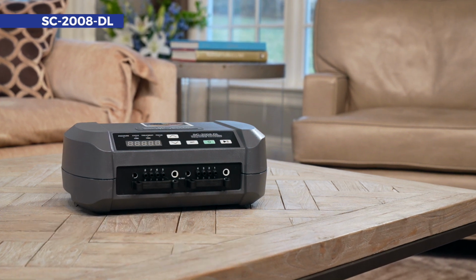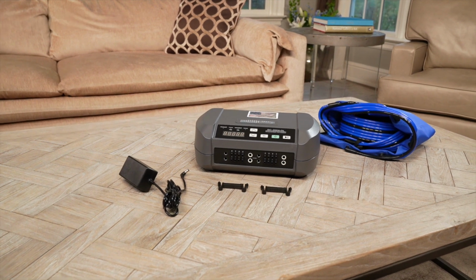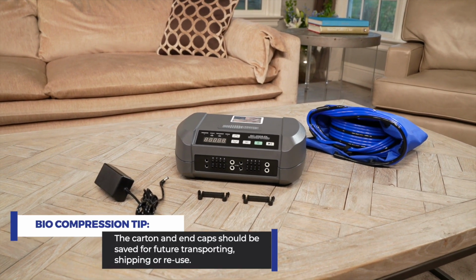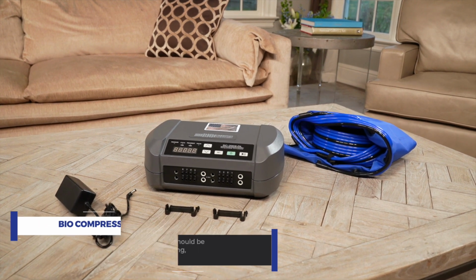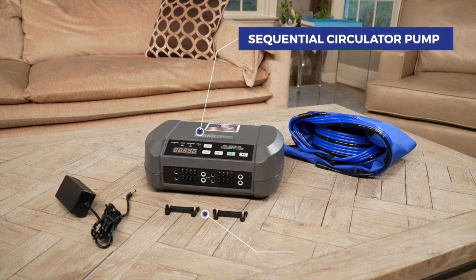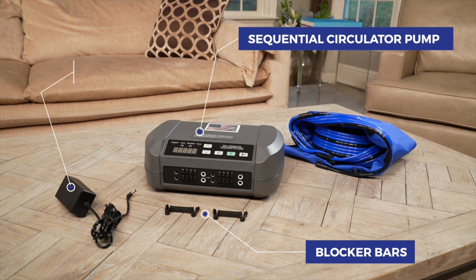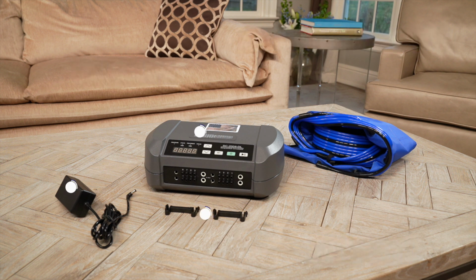Let's get started. First, unpack your biocompression pump and take out all of the components. The carton and end caps should be saved for future transporting, shipping, or reuse. Make sure you have the following items in the box: a sequential circulator pump, blocker bars for use during single garment therapy, a power cord, an instruction guide. Your garments have been shipped separately and are necessary for operation and treatment.